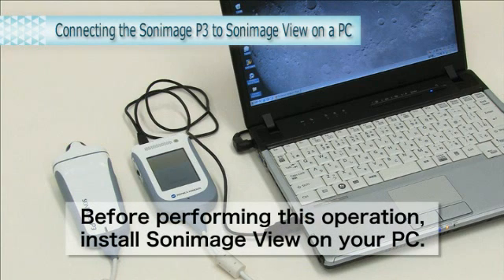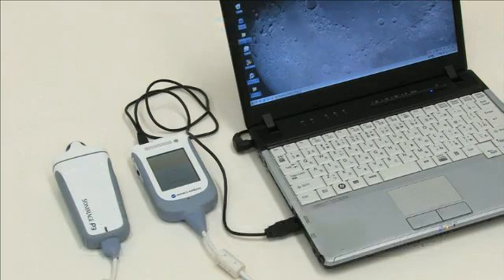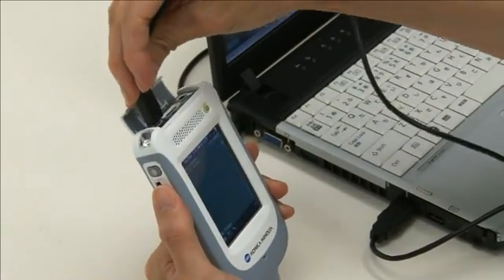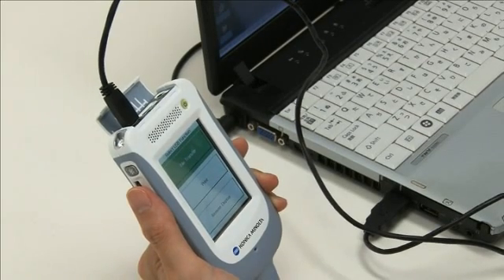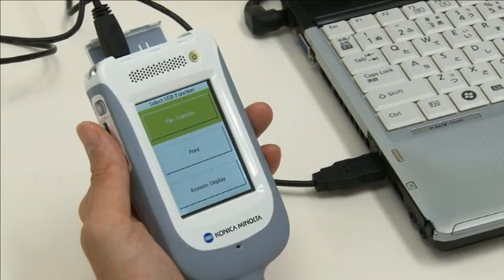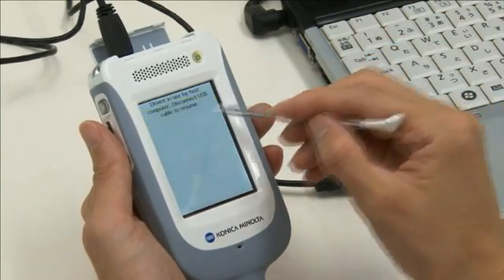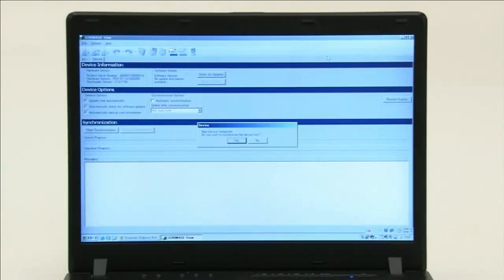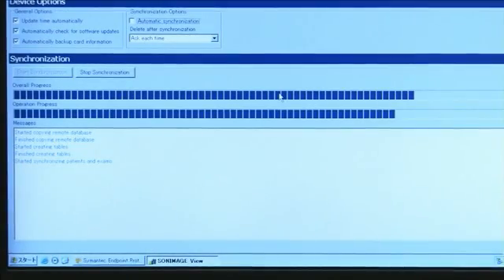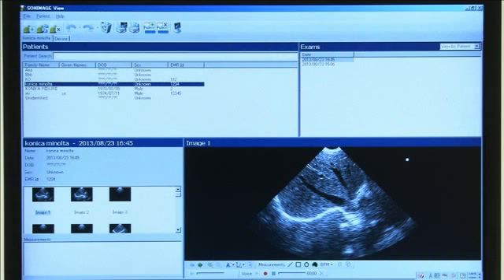Image data saved on the device can be transferred to a PC. First, connect the mini USB terminal on the top of the device to a PC using the included USB connection cable. On the PC, double-click the desktop icon. On the device screen, click File Transfer. You will be asked whether you wish to transfer the file. Click Yes to start the file transfer. When you click the patient icon, the image data from the device can be viewed on the PC.